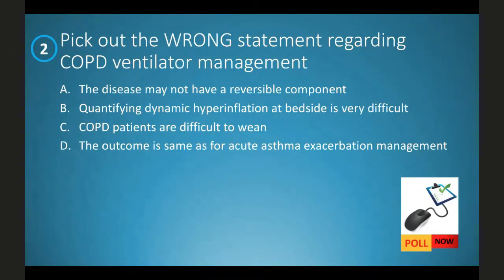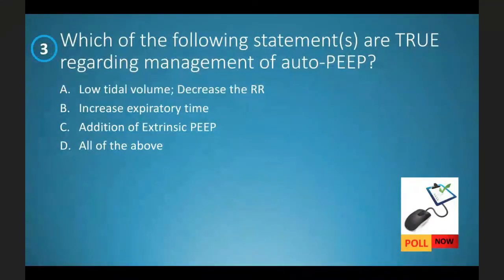Okay, I'll move to question number 3. Which of the following statements are true regarding the management of auto-PEEP? Option A, low tidal volume, decrease the respiratory rate. Option B, increase the expiratory time. Option C, addition of extrinsic PEEP. Option D, all of the above.